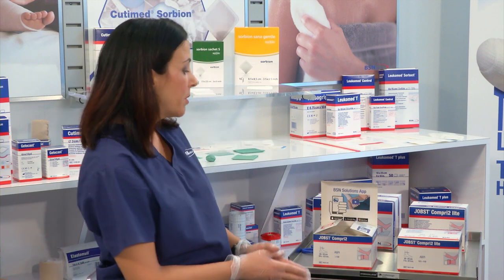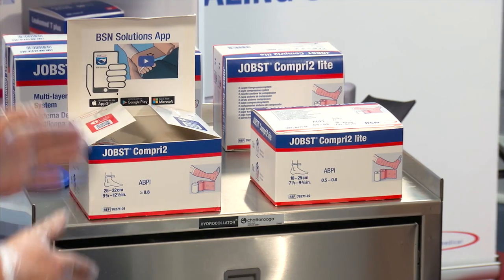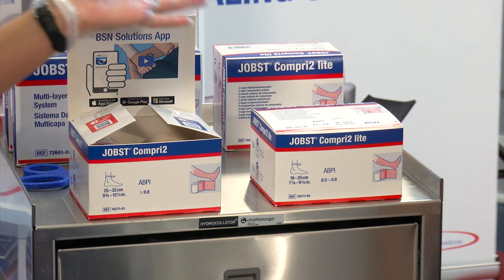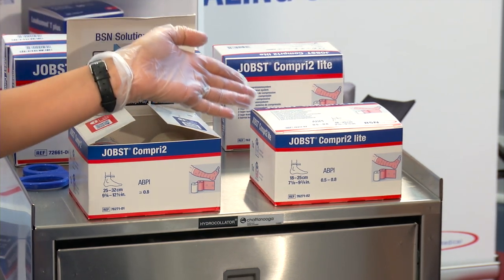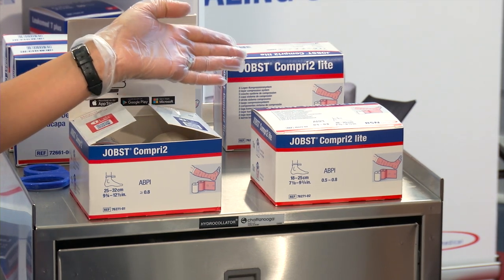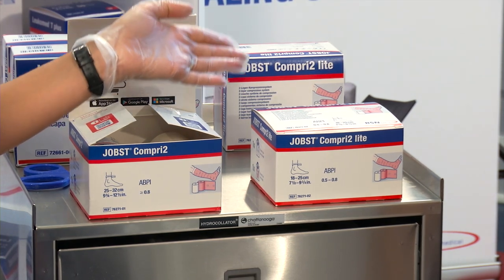Jop's Compr2 comes in two compression classes. Jop's Compr2 delivers 40 millimeters of pressure and is used for patients with an ABI of 0.8 or greater. Jop's Compr2 Lite is for patients with mixed disease, delivers 20 to 30 millimeters of pressure, and is for patients with ABIs of 0.5 to 0.8.